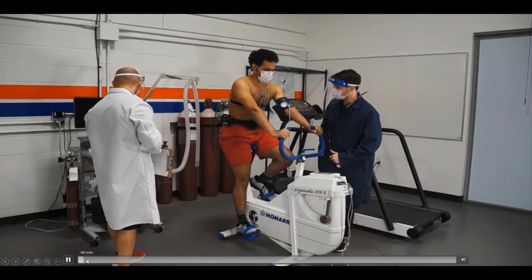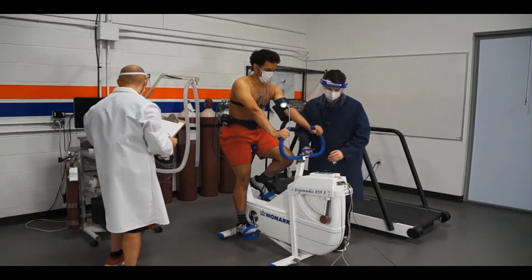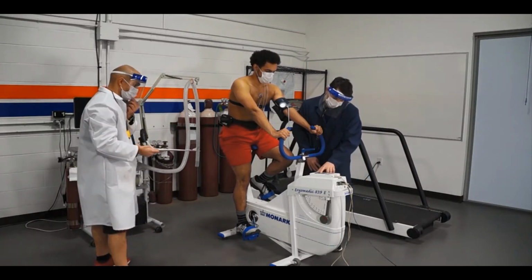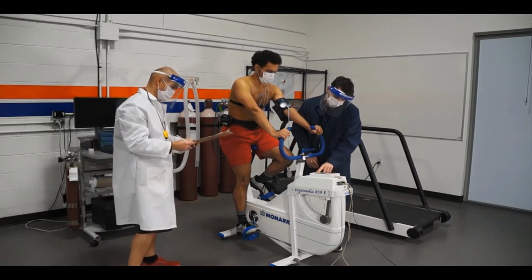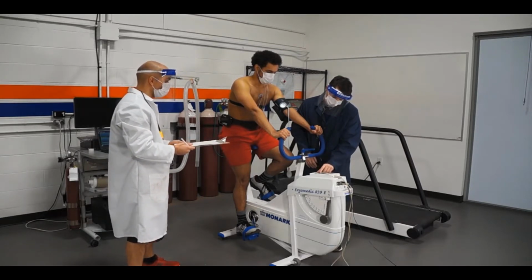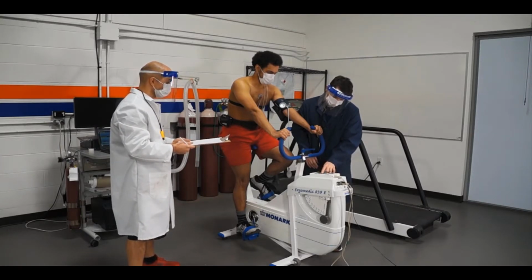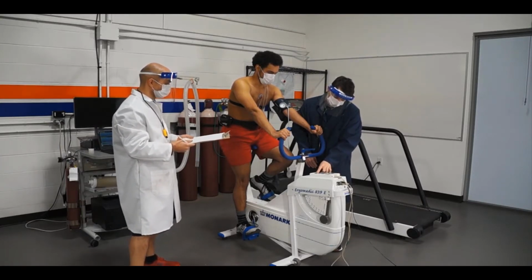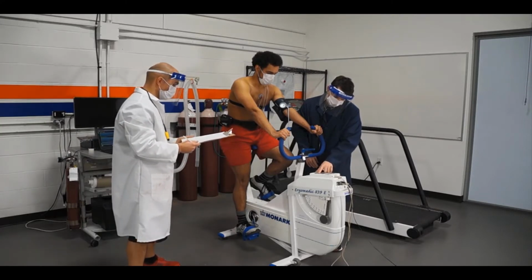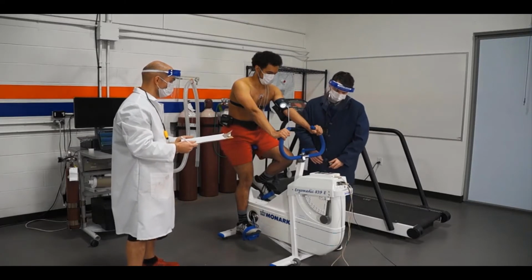So this should look fairly familiar actually if you're watching this from exercise physiology, because I want to show it again and the test is exactly the same. I just want you looking for different things. Before, when we were talking about cardiac output, specifically looking at the stroke volume and heart rate measures that the PhysioFlow our participant is wearing is measuring, but everything else is exactly the same that you would run in an indirect test.